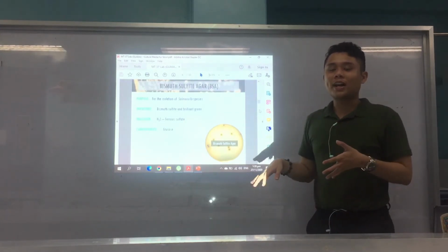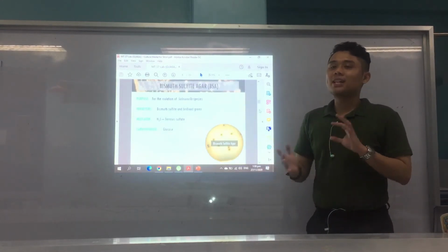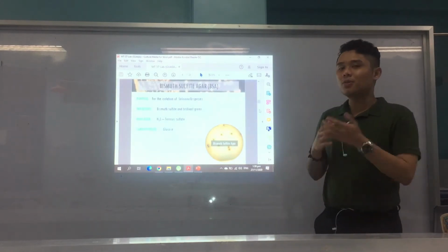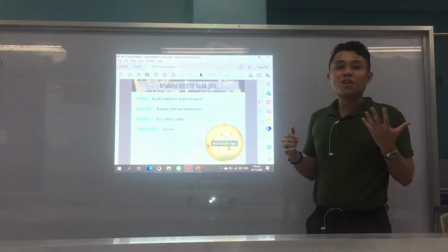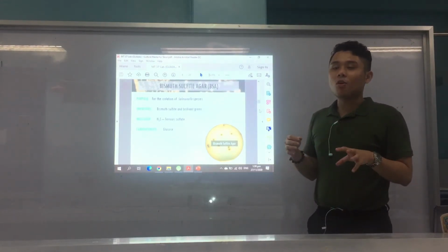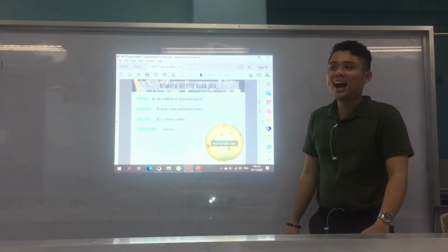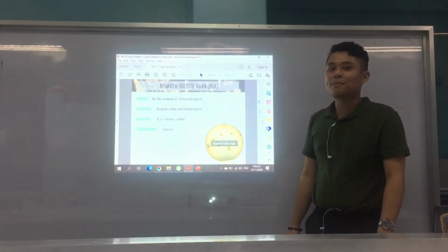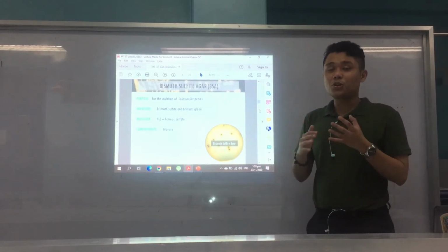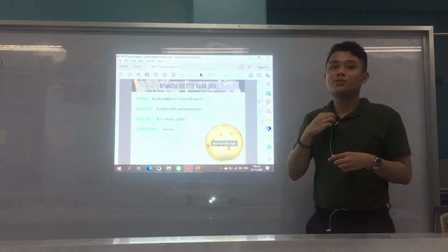Okay? Alright. Now, if you look into the presentation and our discussion, most of the remaining culture media after MacConkey agar are the ones good for the isolation of Salmonella and Shigella. Because again, these two are really considered to be enteric pathogens. The rest, like the Enterobacteriaceae, E. coli, Citrobacter, Klebsiella, those are opportunistic pathogens. But under normal conditions, they are unlikely to cause infection, unlike Salmonella and Shigella, which are considered true enteric pathogens. So if you'll notice, the culture media we discuss after MacConkey agar, most of them, if not all, are usually for the isolation of Salmonella and Shigella.